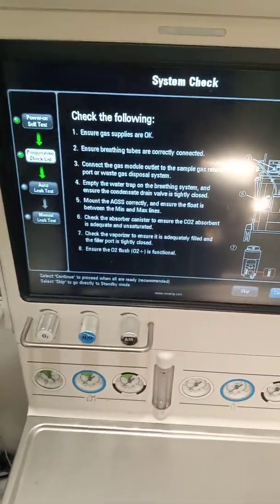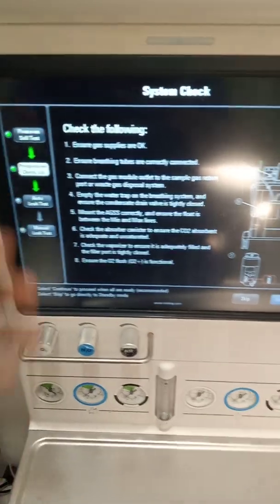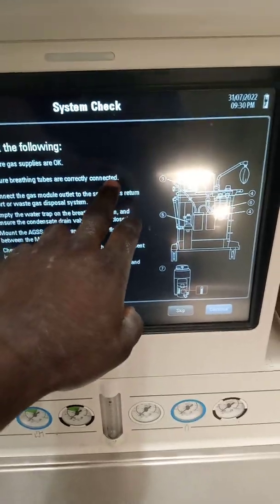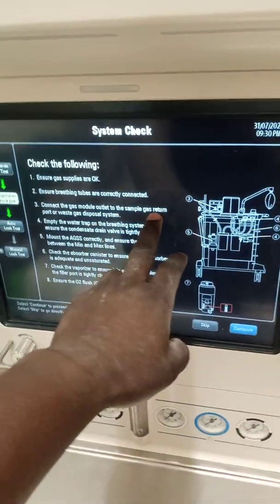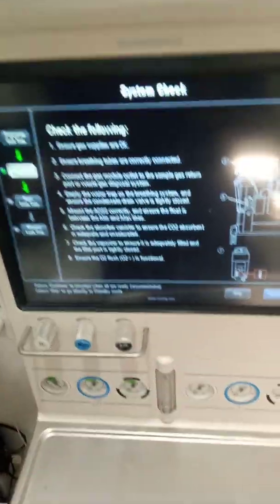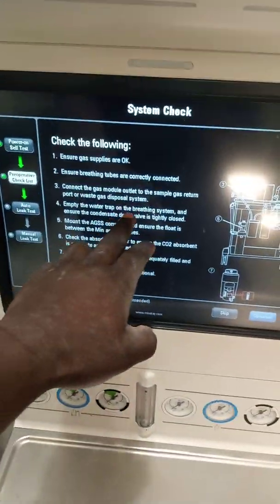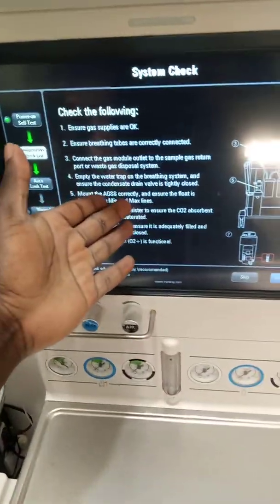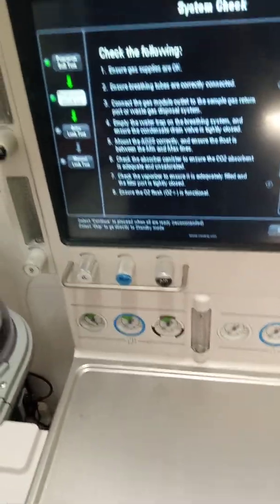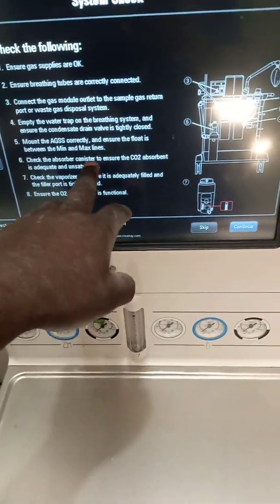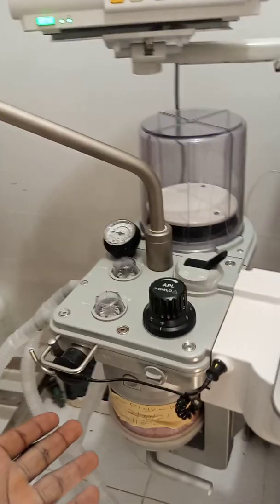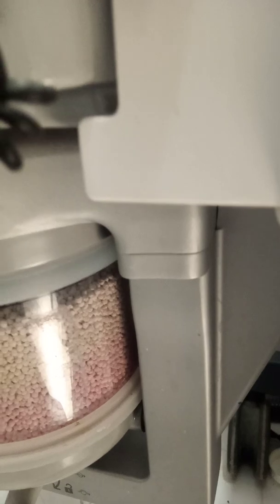Check the following — these are instructions that are going to guide us along our calibration. First, ensure gas supplies are okay — yes, we have our gas supplies. Ensure breathing tubes are correctly connected — these are the breathing tubes and they are correctly connected. Connect the gas module outlet to the sample gas return port or waste gas disposal system — everything is right here. Empty the water trap on the breathing system and ensure the condensate drain valve is tightly closed — it is already done. Mount the AGSS correctly and ensure the float is between the minimum and the maximum lines — that is also already done. Check the absorber canister to ensure the carbon dioxide absorbent is adequate and unsaturated.